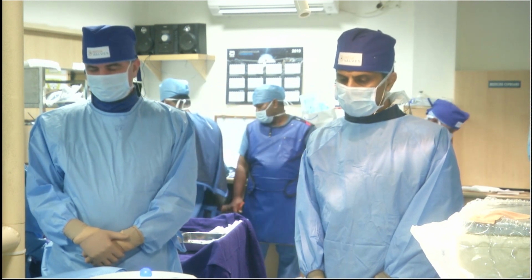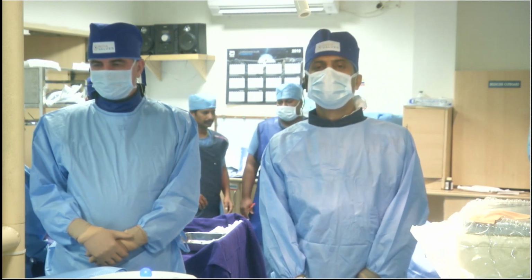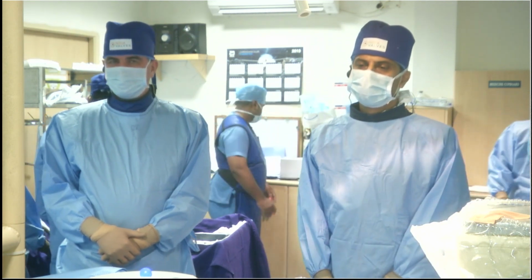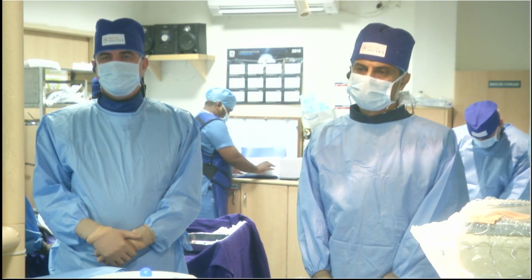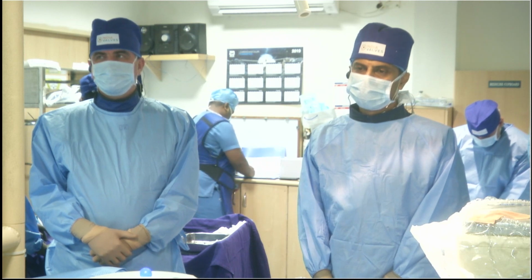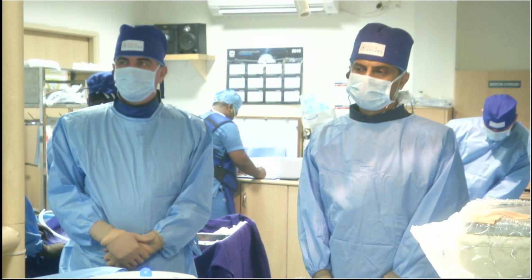It should be okay. If you look at the sinus of Valsalva, we can see a calcium chunk on the leaflet of the non-coronary cusp, but the size of the sinus of Valsalva is larger than 30. So this patient has a sufficient size of the sinus of Valsalva.